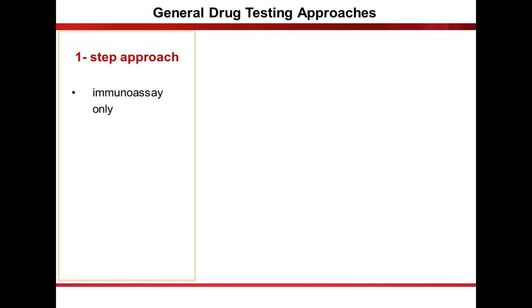So in the next slide, I'm just going to share with you some general drug testing approaches that are used. This is not meant to be a prescription for you to do any of these, but I just want to share with you what's out there and to open your mind to the possibility of using different approaches depending on the clinical scenario. So the first approach that I'll describe is the one-step approach.